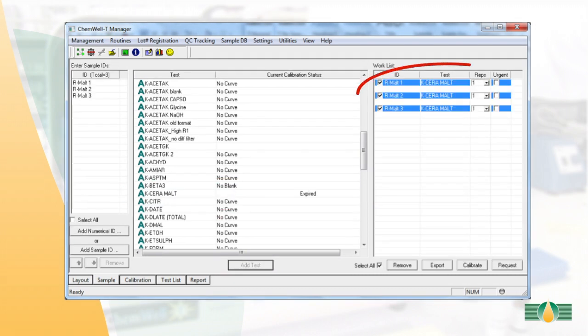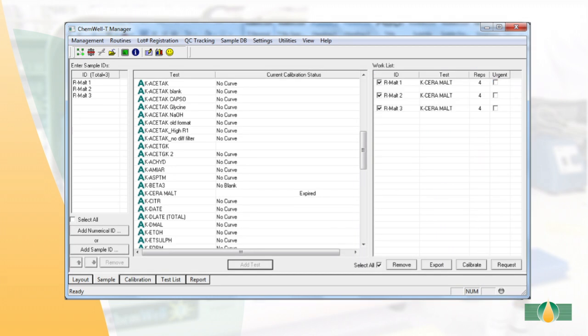A list of the tests will appear on the right-hand column. Select the required number of replicates—in this example, we are performing quadruplicates—and then select request.